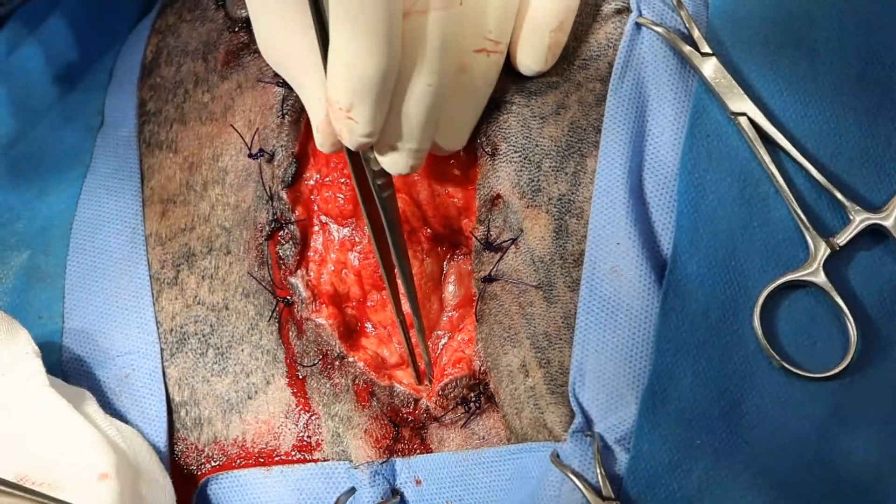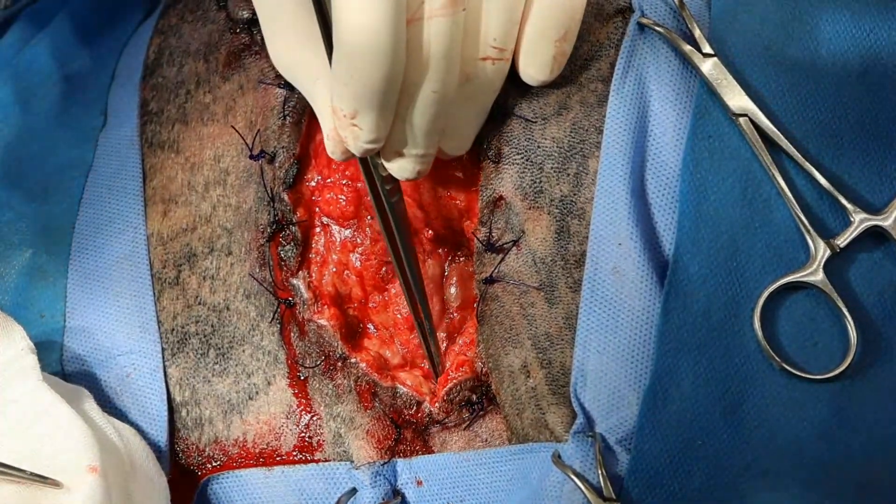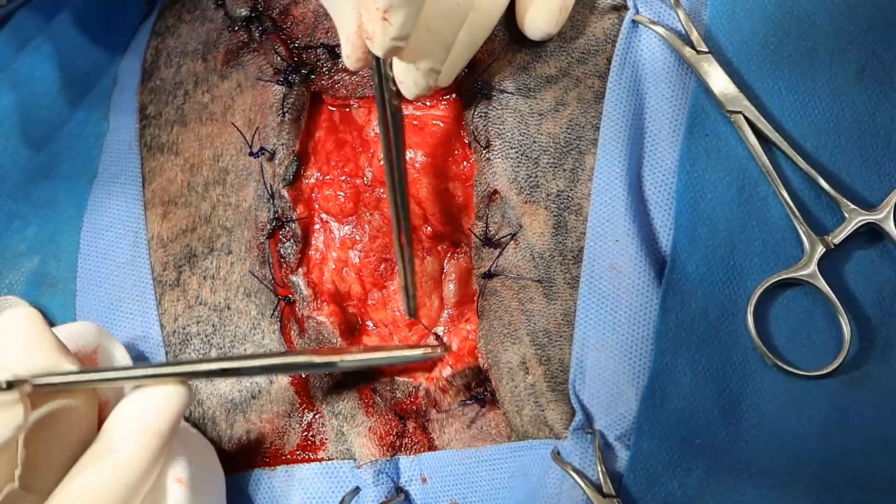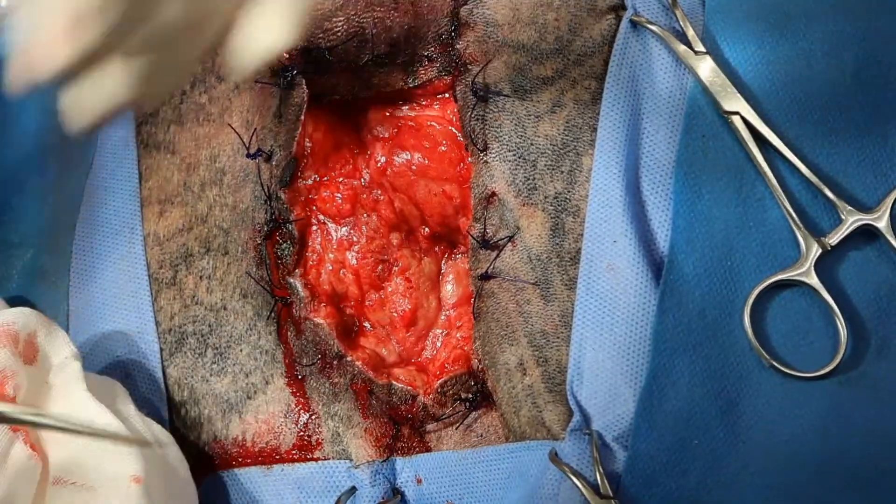I'm trying to take out any unneeded suture, because I want to avoid any foreign body in here that's going to potentiate an infection.